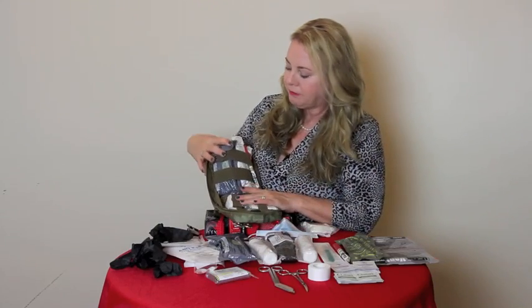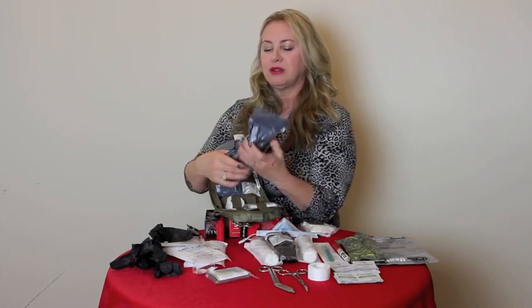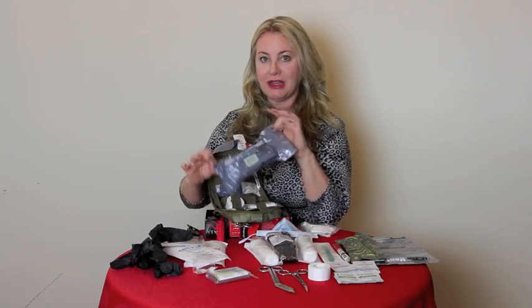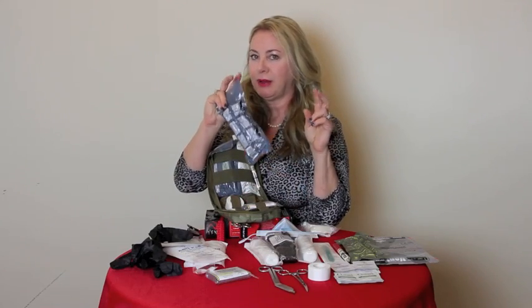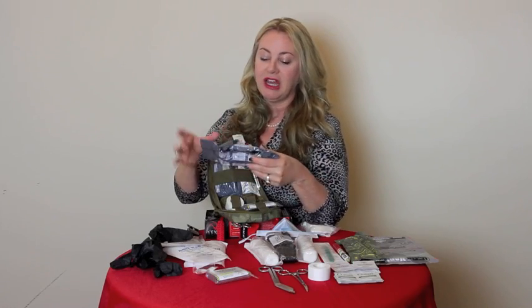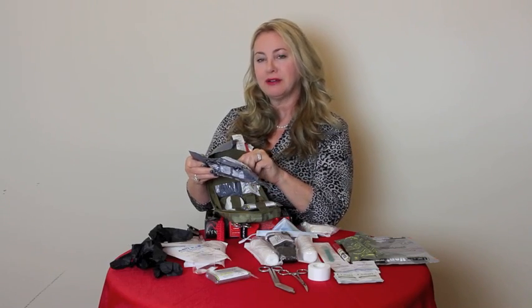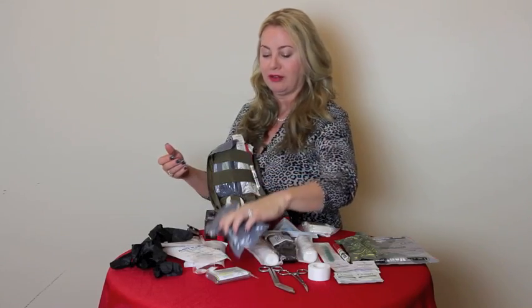Now, next you will find an Israeli bandage or an emergency bandage. This is a really cool item. When you open this up, this has a pad. It is in a sterile package. In fact, this one was made in 2014 and doesn't expire. We all know pretty much about gauze in sterile packages expiring. If it's intact, it's going to be fine for a very long time. But this one says 2022. So don't have to worry about this expiring in your bag for very long.